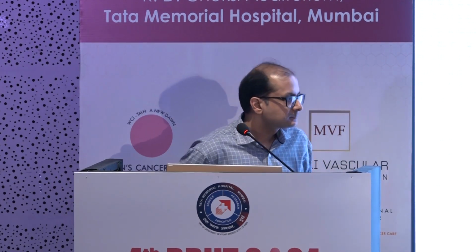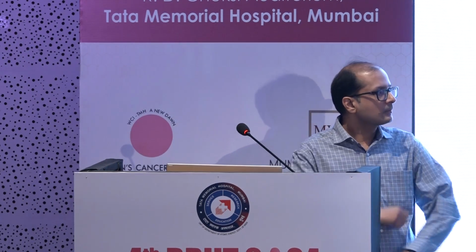So normally on the CEM, you go beneath the undersurface of the lesion so that all the suctioning gets on the top of it, and then all the suctioned material comes in. So this is what it is. Yeah, so I have started the video.